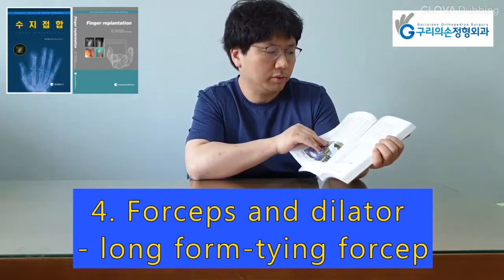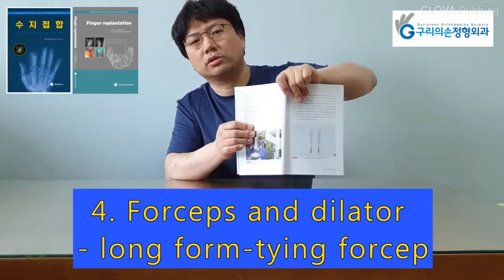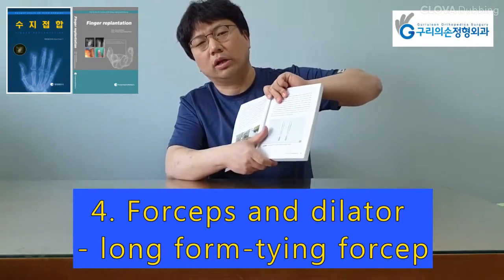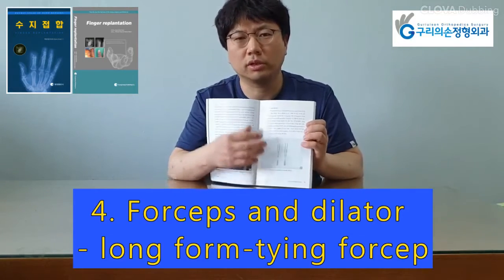Commonly available forceps can be divided into toothed and non-toothed forceps, smooth-tipped forceps, and tying forceps. They are also available in different lengths: short form and long form.